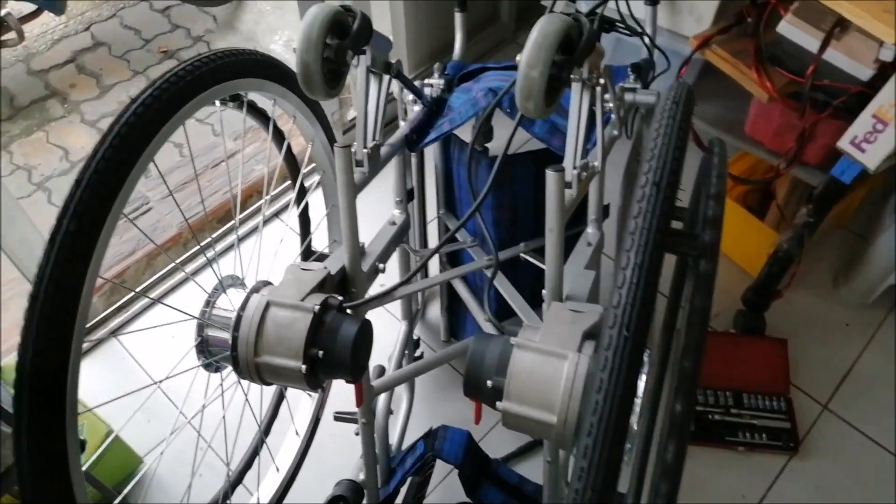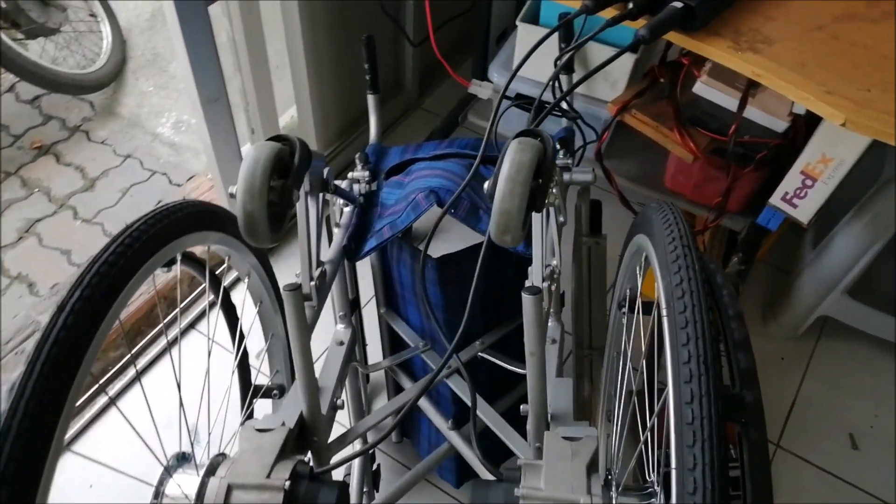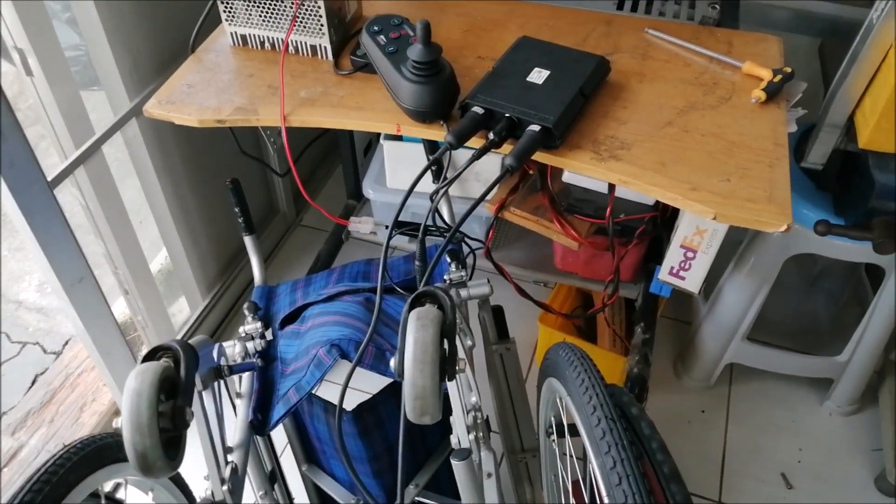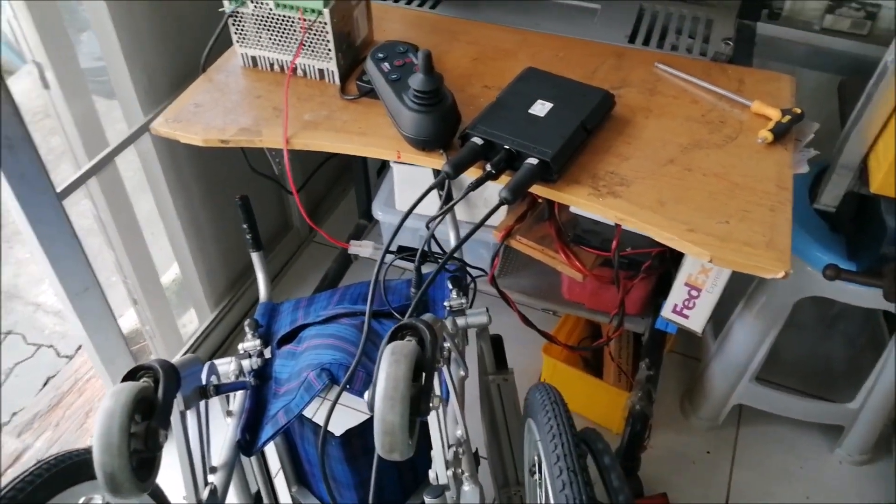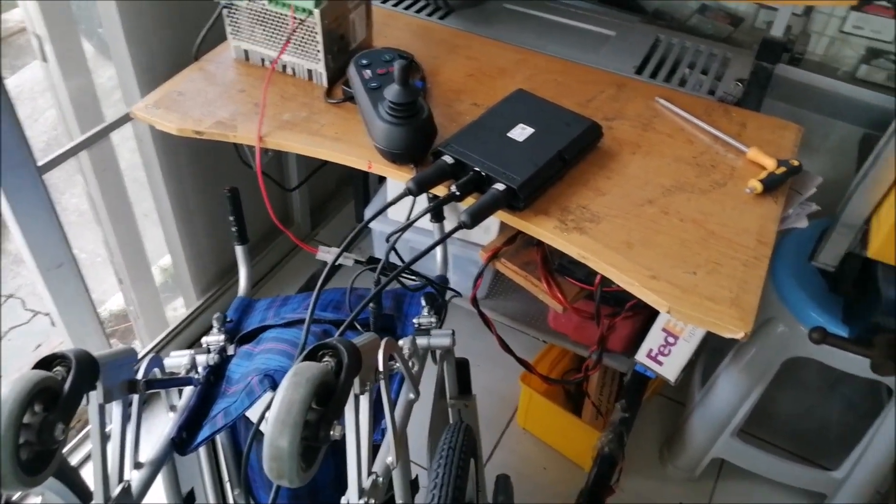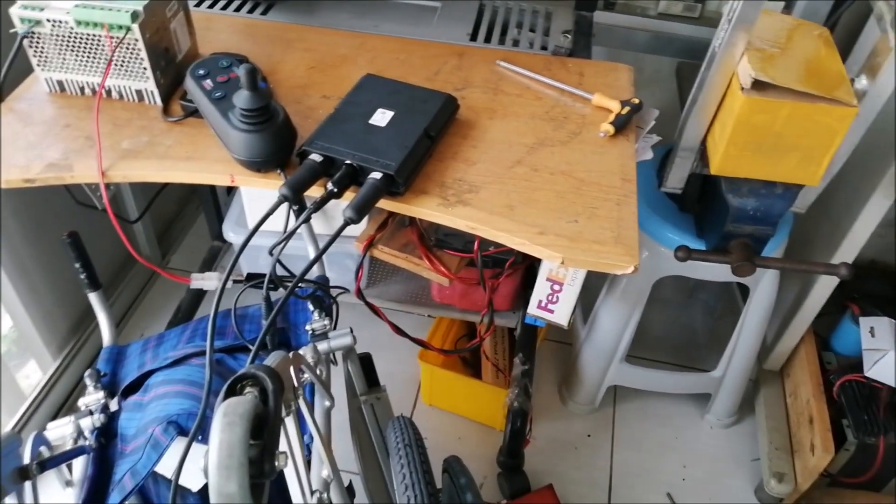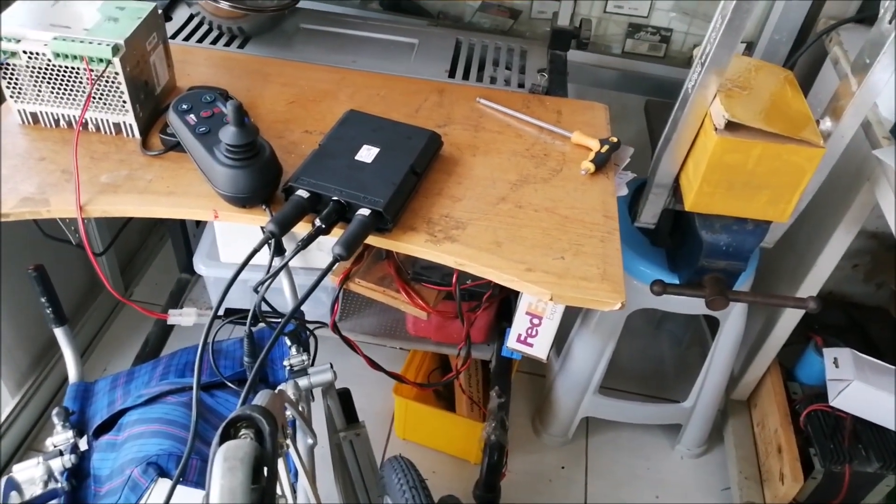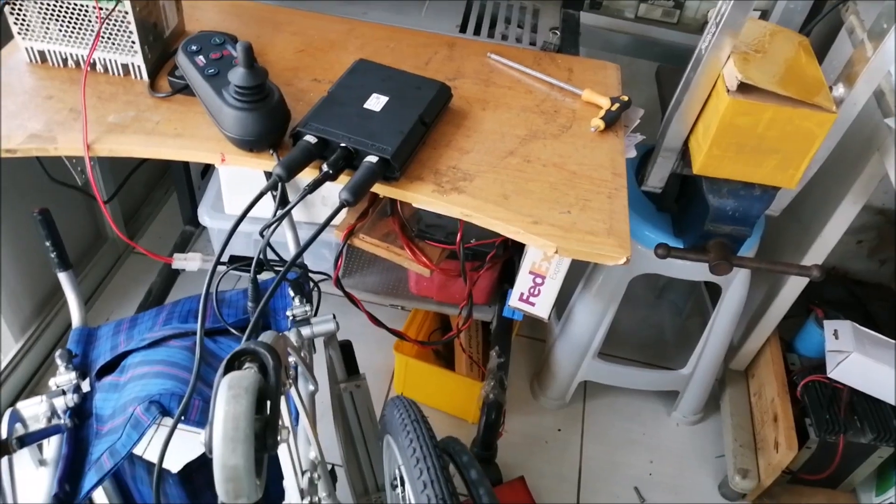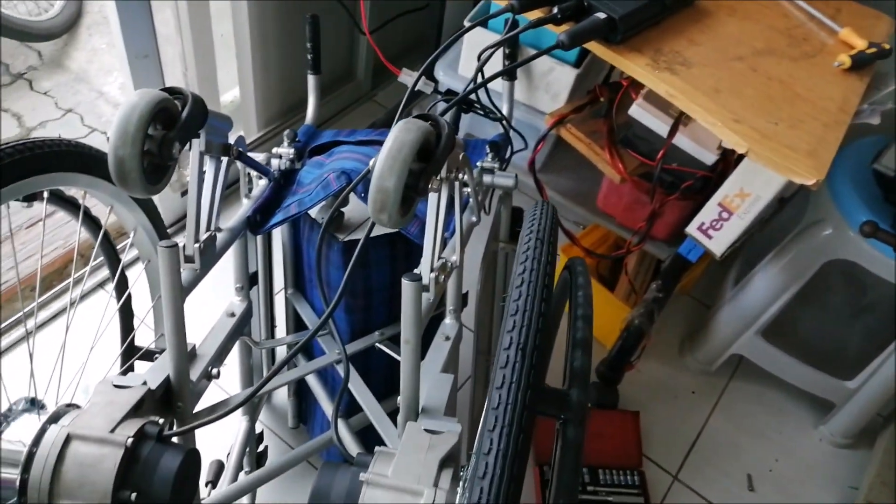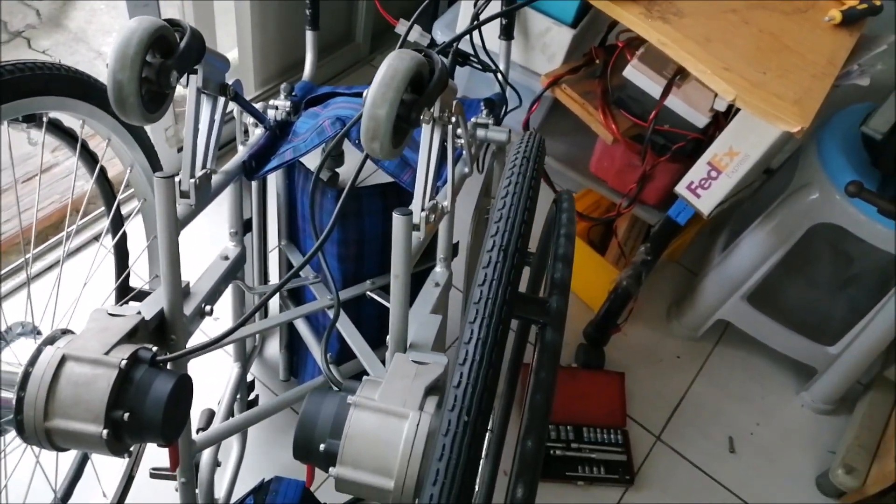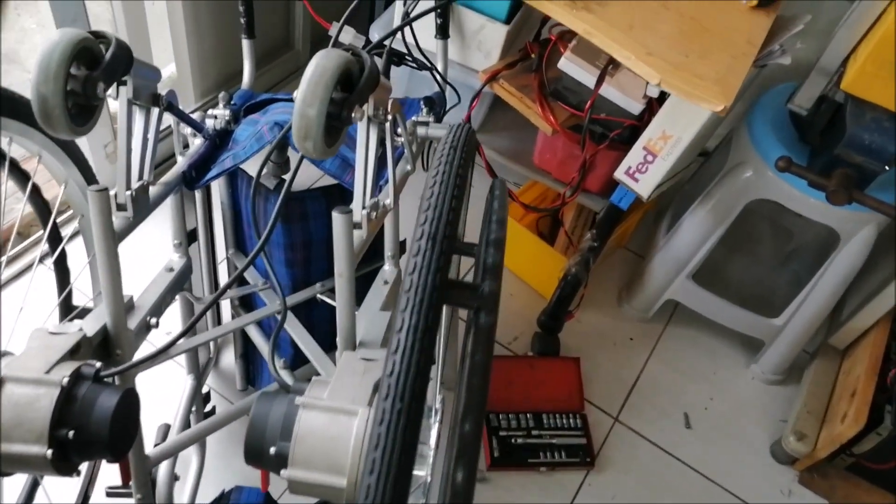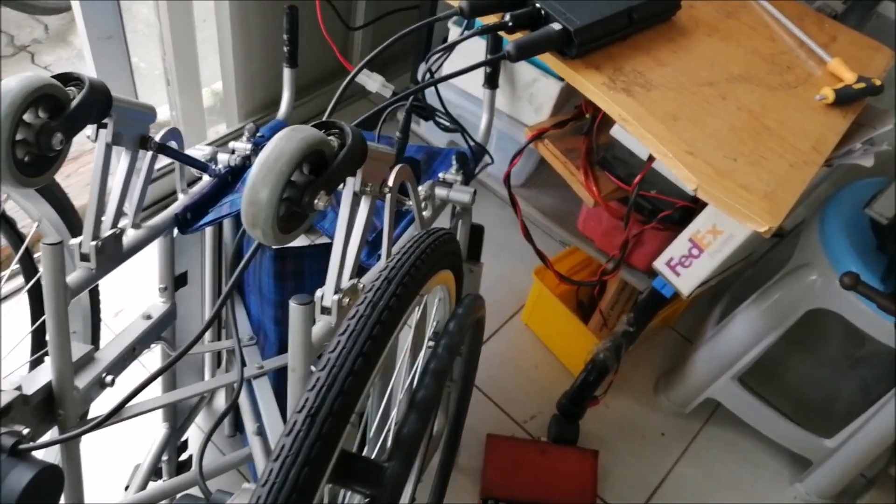Our brushless e-wheelchair control system allows for making it possible for users to operate the wheelchair freely and steadily and move in any direction.